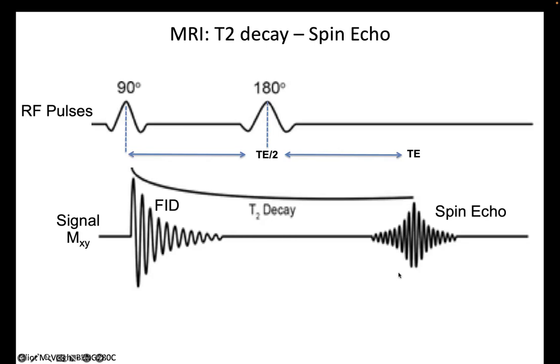And for many, many years at the beginning of MR, because things had to move more slowly, like switching gradients and things like that, this was the pulse sequence of choice because it gave you a fairly long period of time in order to encode, switch your gradients on and get everything going. Nowadays, I would say most of MR imaging is done on this signal right here. You just do an RF pulse and then you start imaging right here. And because you can get everything done very quickly over here, you don't have to wait to get over here.